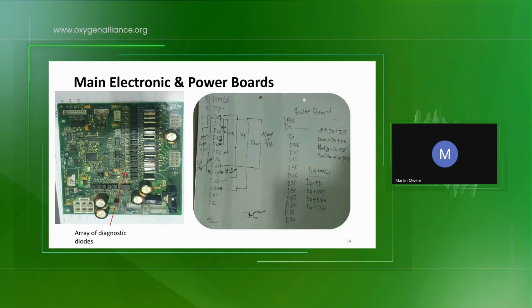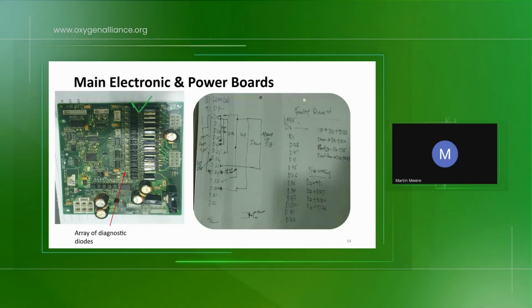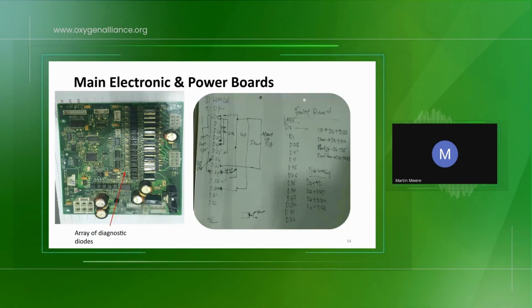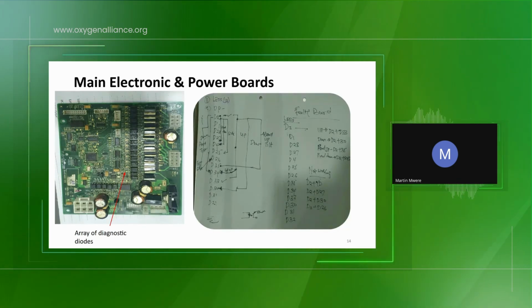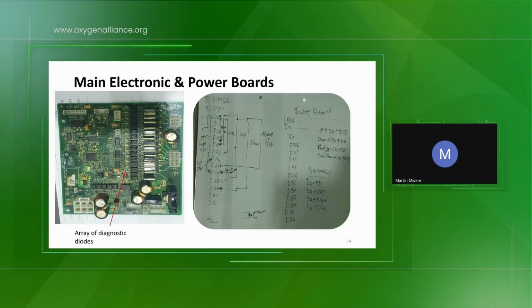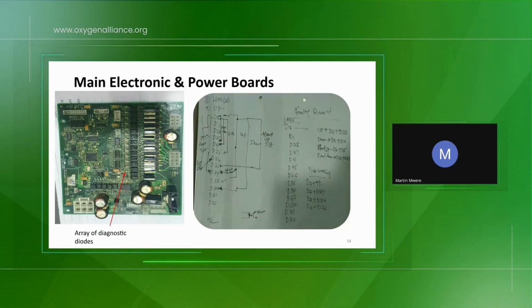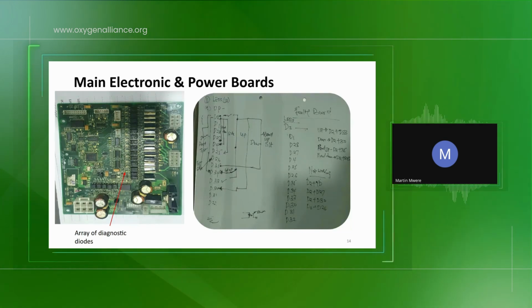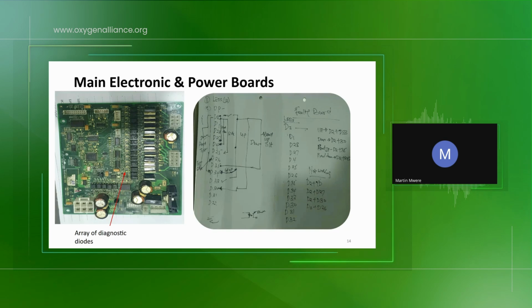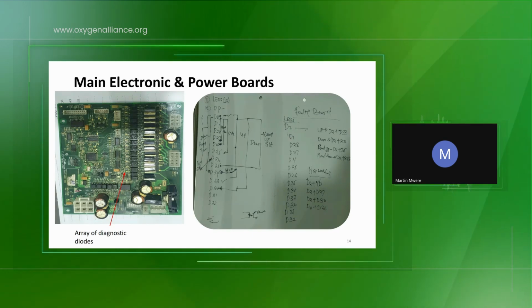If one of your MOSFETs is not working, you are not able to attain the movement of the chair. You need to check any of these MOSFETs for any change of color. You'll find that one of these has changed color. Is it brown? Is it white? That change of color means that MOSFET is not working. You also need to check the other side for any dry joints.